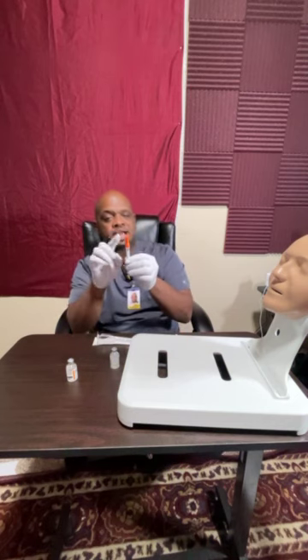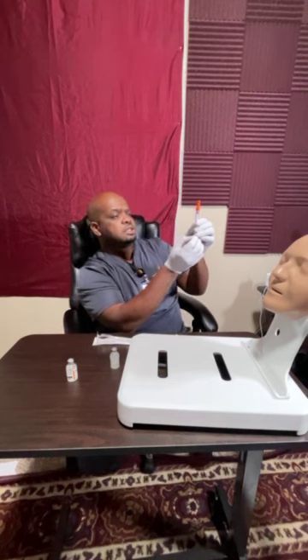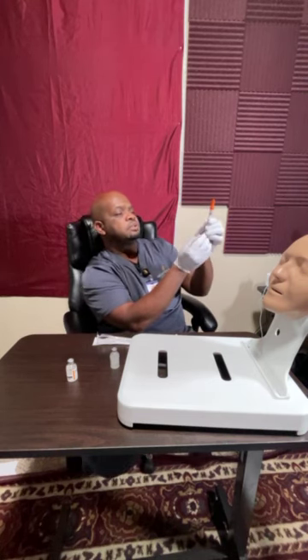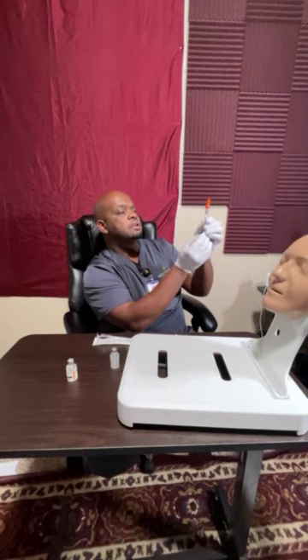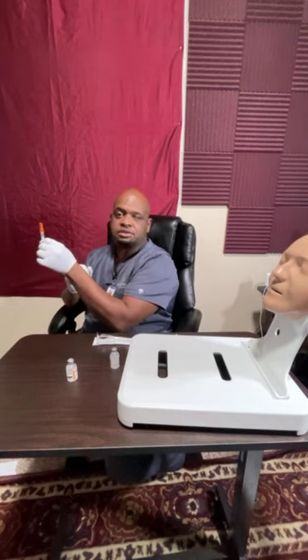With the cap still on, we're going to put 8 units of air into the first bottle. 8 units of air. Okay, let the nurse verify. She's just verifying that there's 8 units in here.